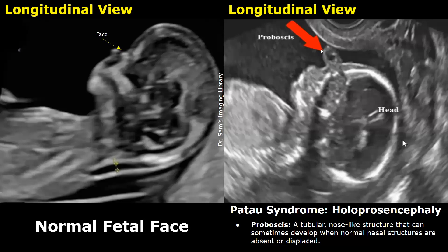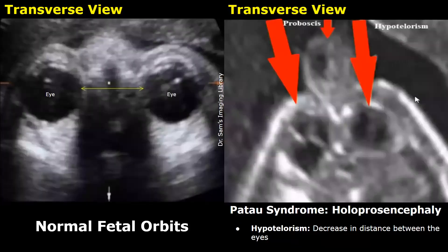Alobar holoprosencephaly is usually associated with severe facial abnormalities. A proboscis is a tubular, nose-like structure that is seen at the forehead. This structure is seen in longitudinal view. In this image, this is the proboscis. It is usually associated with holoprosencephaly. Hypotelorism refers to a decrease in distance between the eyes — they will be seen much nearer to each other. A proboscis is also present in this image. Both of these features are usually seen in holoprosencephaly.